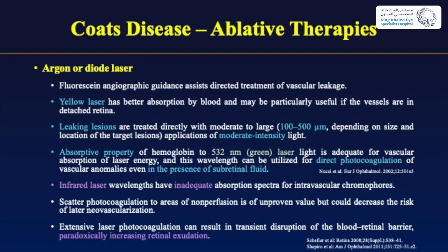So we can use FFA guidance to treat. Yellow laser has better absorption. We usually treat the leaking lesions directly with moderate to large spot size of moderate intensity. There is an important basic concept to understand.